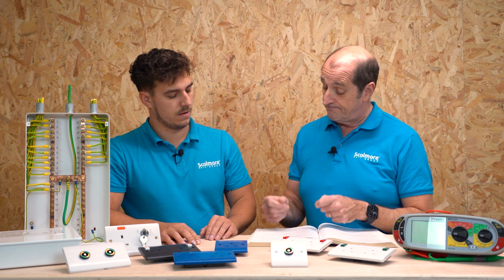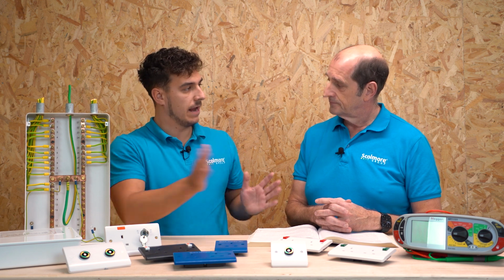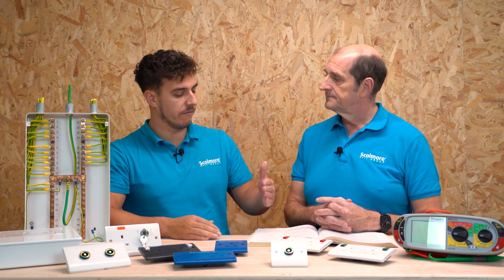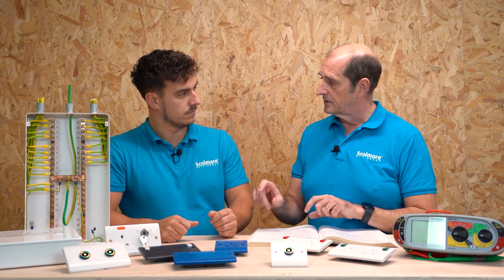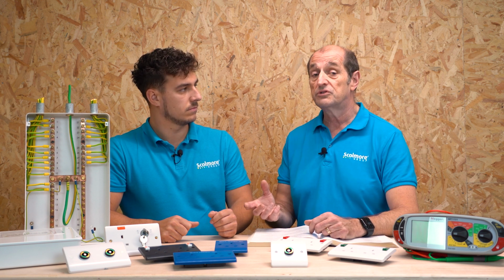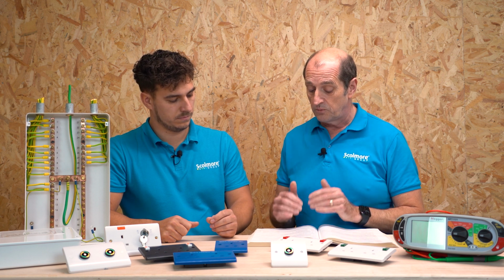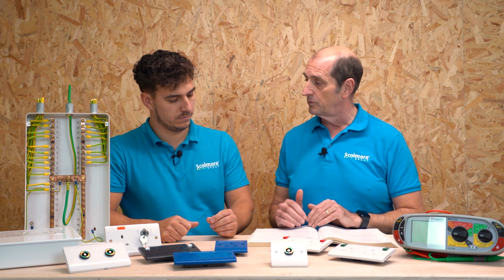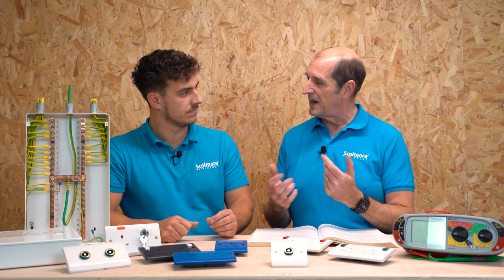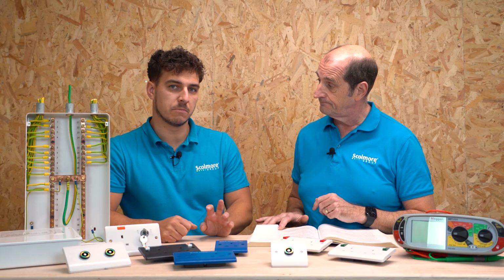Are there any specific tests that need to be carried out under HTMs, or is it just saying HTMs refer back to this, make sure that you're following 7671 for all the testing requirements? Generally, in terms of this testing, yes, it sits within 7671, but there is a reference to HTM 0601, and you should reference it, free to download. So there's no excuse. But generally, what we're dealing with here is measuring and getting that 0.2 ohm value. You really should record it, although strictly speaking, at the moment the current certificate doesn't lend itself too readily to that. So it may be that you just record it on a separate sheet and attach it to your EIC, so there's a record. Now there would be a business opportunity for someone.